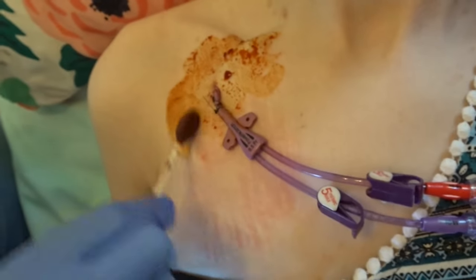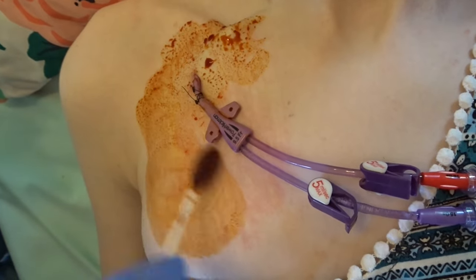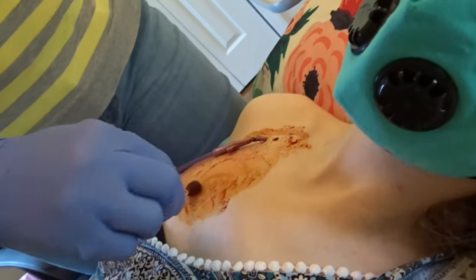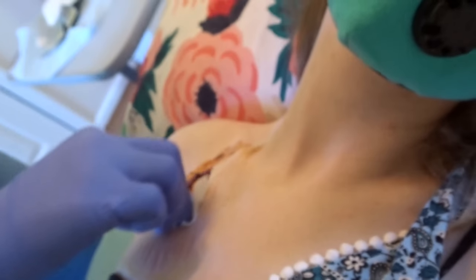The PICC team nurse at the hospital from Florida learned at a conference that alcohol can degrade bared power lines. Since I have a bared power Hickman and I cannot tolerate chlorhexidine, I use betadine and alcohol for my dressing changes.